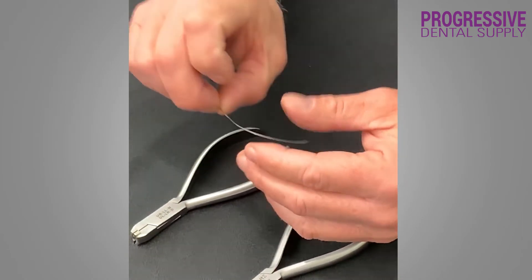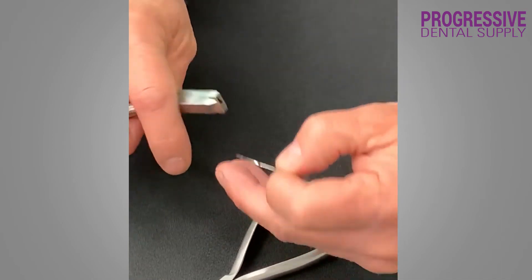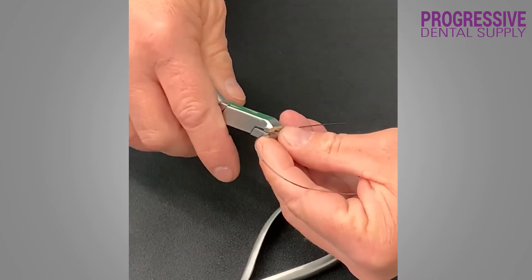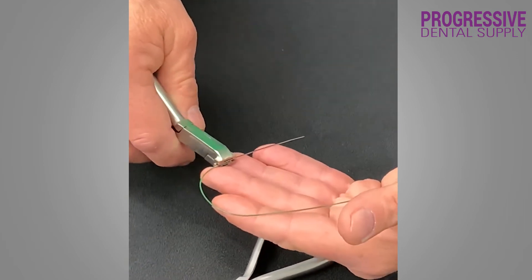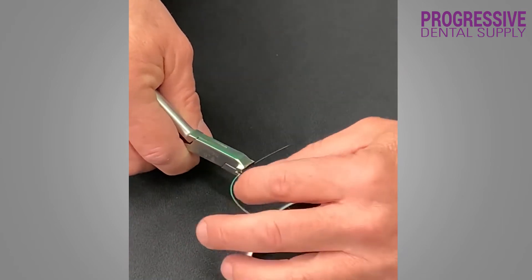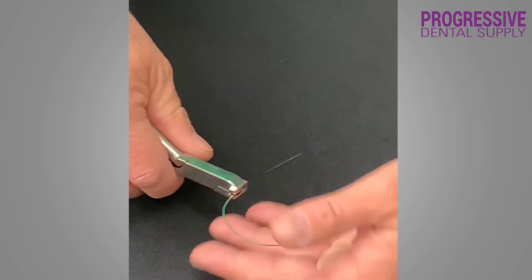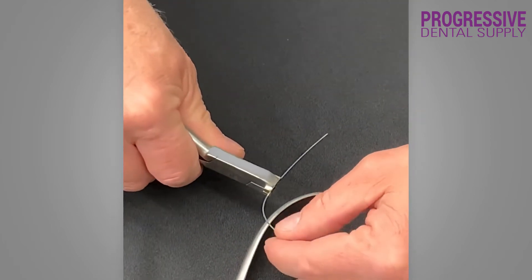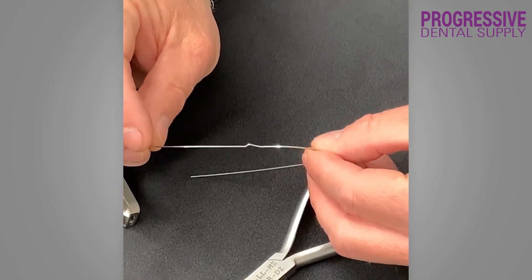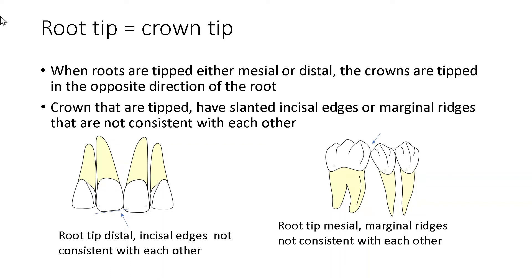I have a 19x25 arch wire, and again I can use these pliers even on 19x25. You just place it in front of the bracket. If this was intraorally, make sure that the wire is not tied to the bracket, and make sure that a couple of brackets behind and in front of the tooth to be bent are loosened up. Then you would place your plier in front of the wire and just give the plier a full squeeze. And here you have your second order bend on your 19x25 arch wire.